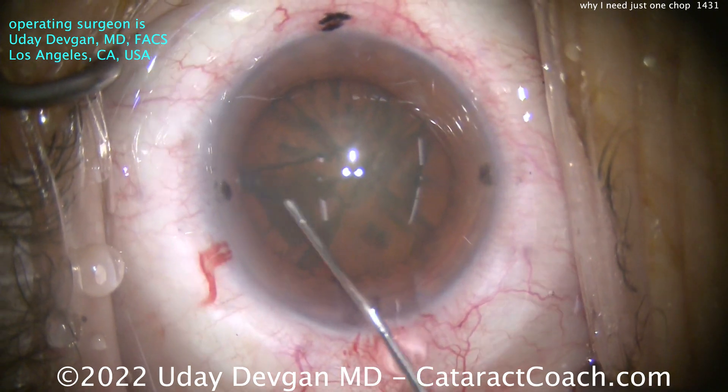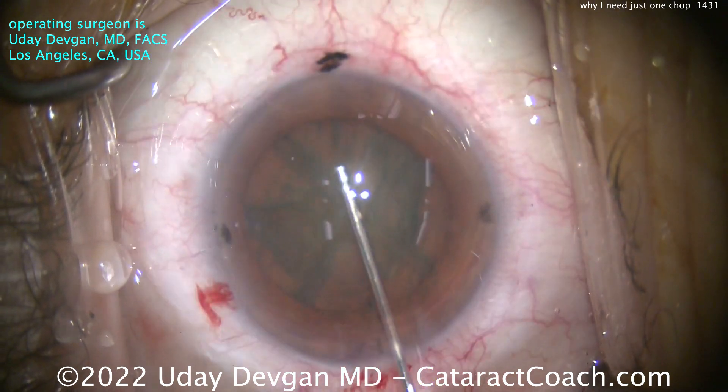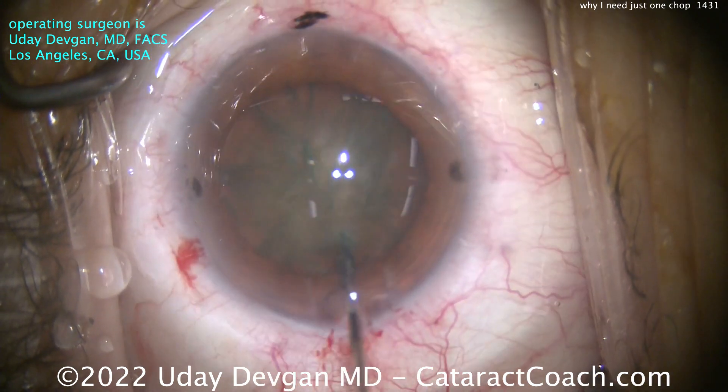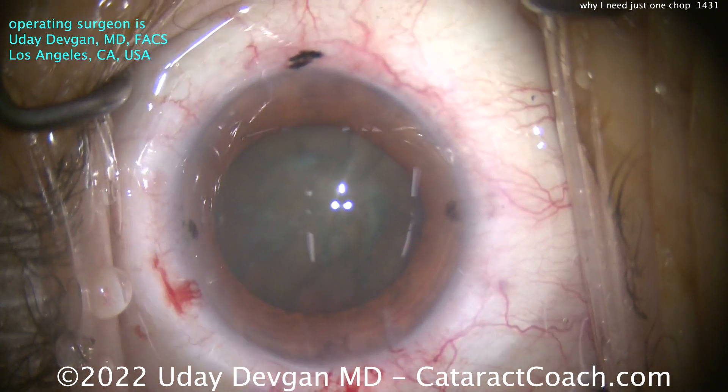Hydrodissection is important to free up that nucleus. We'll tap the center there, and you really want this nucleus to be able to spin a little bit. It's got good spin to it, so you know it's free from the capsular bag attachments.